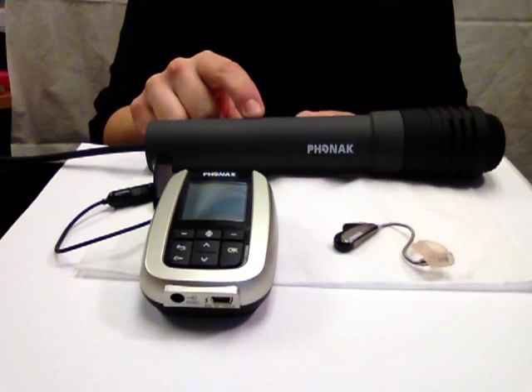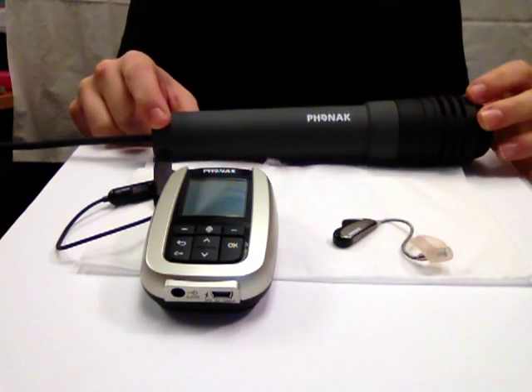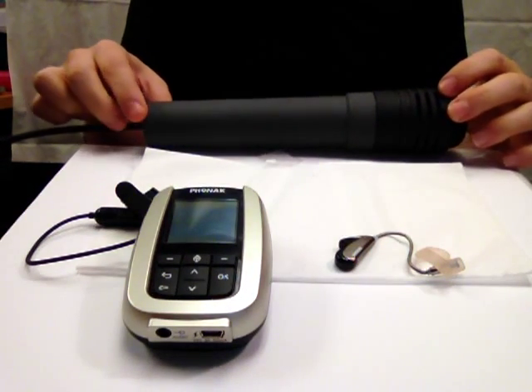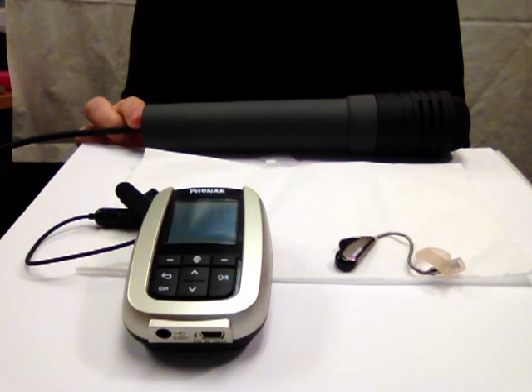If the Inspiro and DynaMic transmitter have been switched off while in the multi-talker network mode, such as before lunch, it can be reactivated after lunch. Multi-talker network mode can be selected by simply turning on Inspiro and pressing continue. In this case, there's no need to reinitiate the network. The DynaMic transmitter will join the network after 8 seconds.